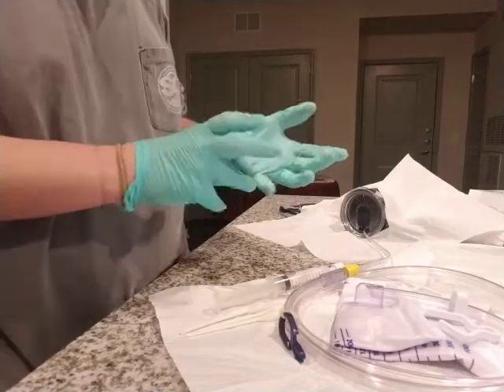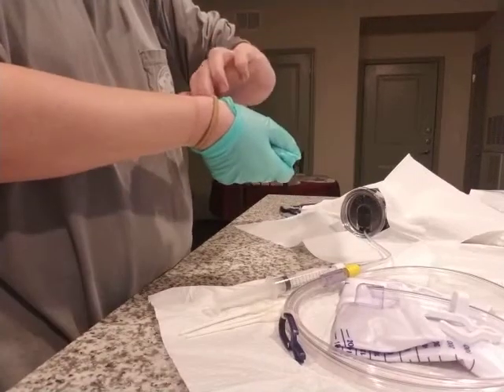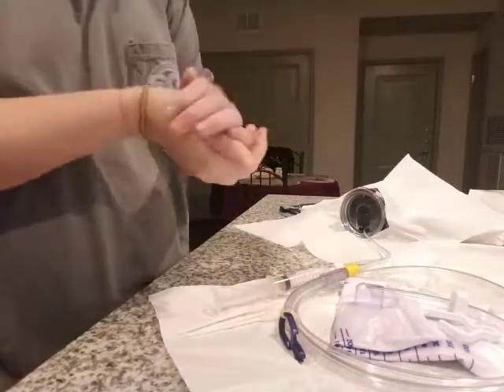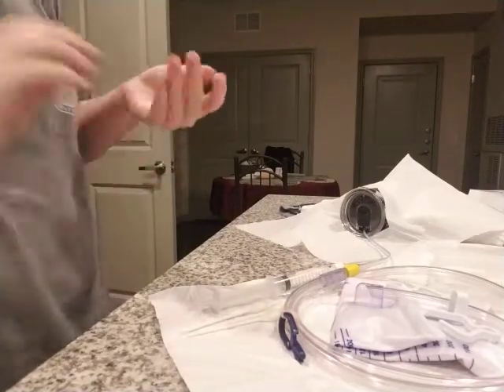And then I'm going to remove my gloves. Perform hand hygiene. And then put on clean gloves.